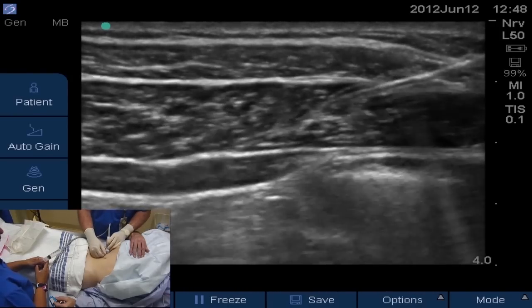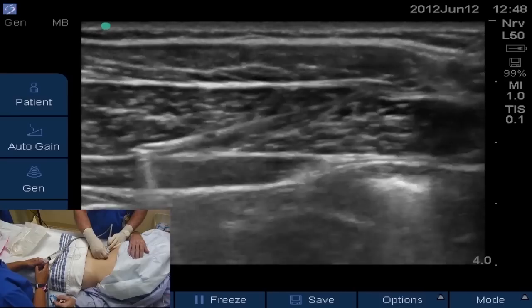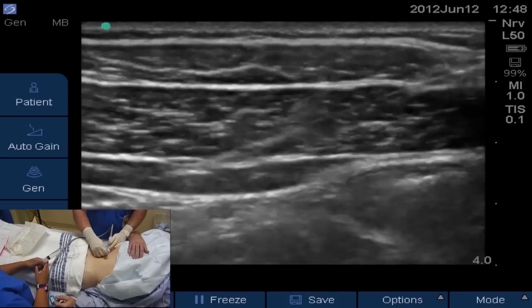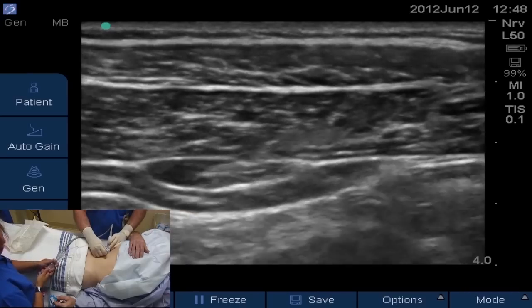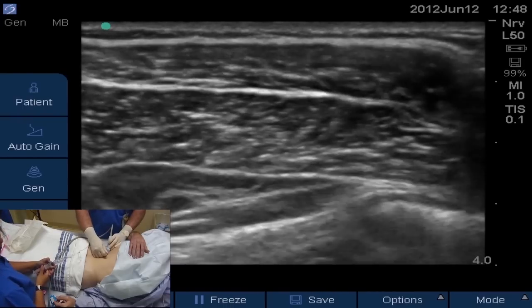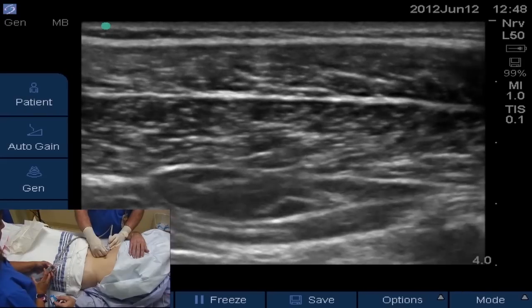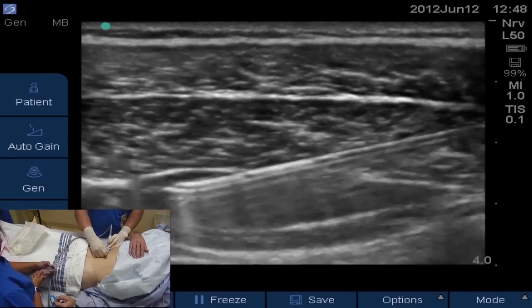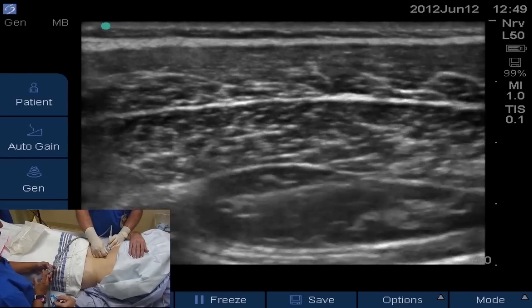Trying to get the needle adjusted just right. You can see this needle very easily. There we are — it looks like it's in a great location. We start injecting. It's very easy to see the plane between the transversus abdominis muscle and the fascial layer of the internal oblique open up. We're certainly in this plane between the two fascial layers. We inject and advance the needle more posteriorly, keeping the space open and trying to get to the posterior edge of the transversus abdominis muscle, where more nerves are traversing through this plane.